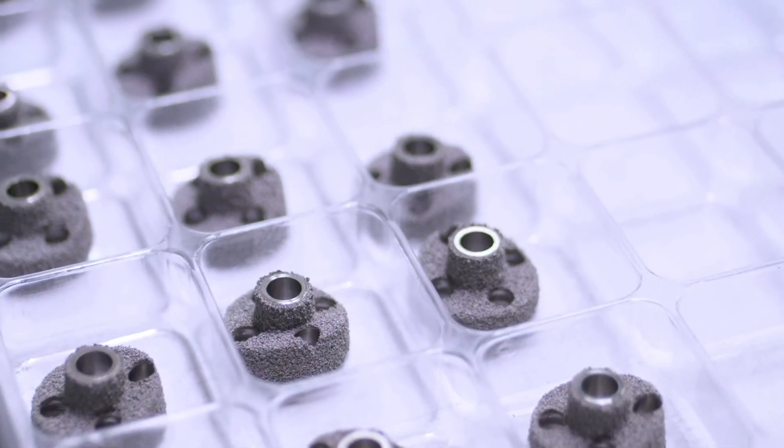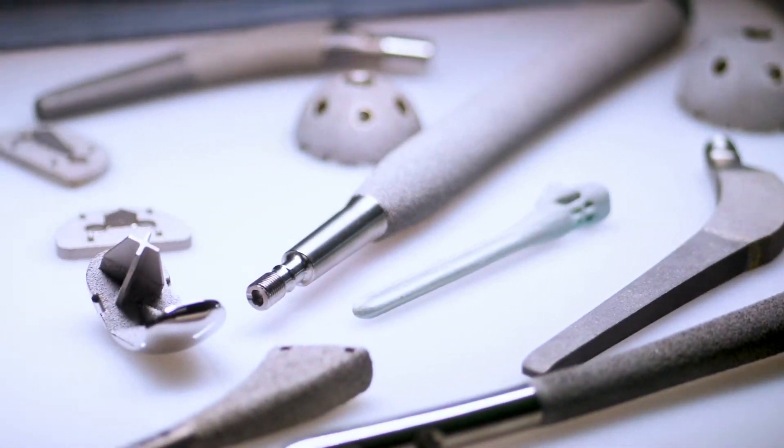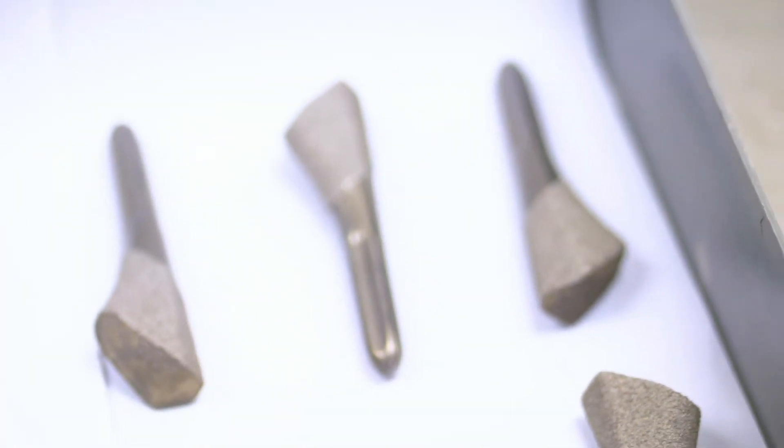The HA coating's purpose is to speed up the adherence of the bone to the implant. The HA coating — hydroxyapatite — is crushed bone. And what it does, it promotes your tissue to start growing faster to adhere to the implant.